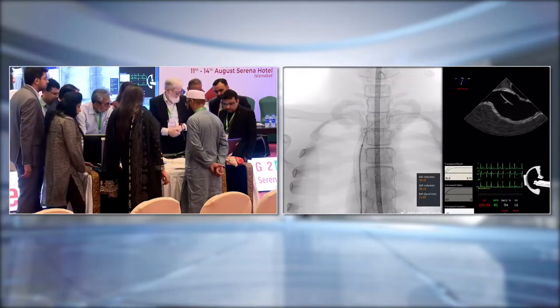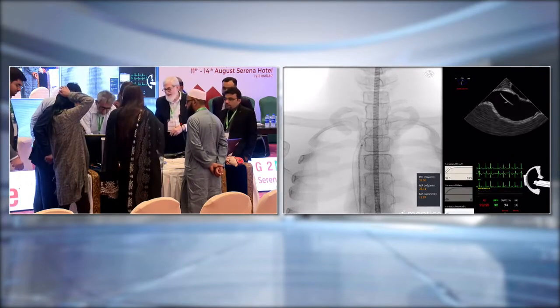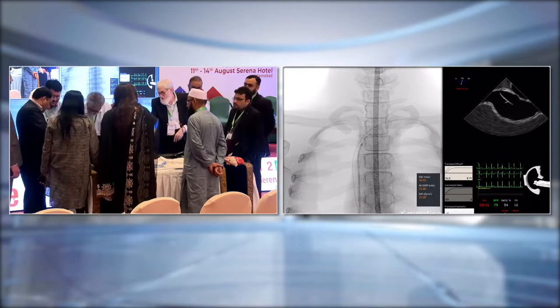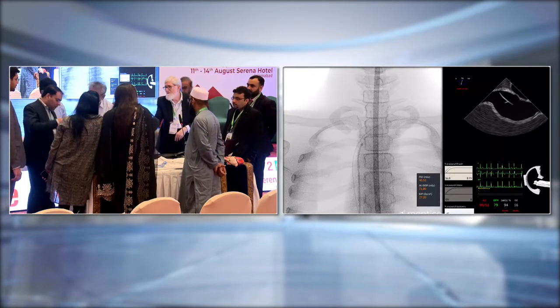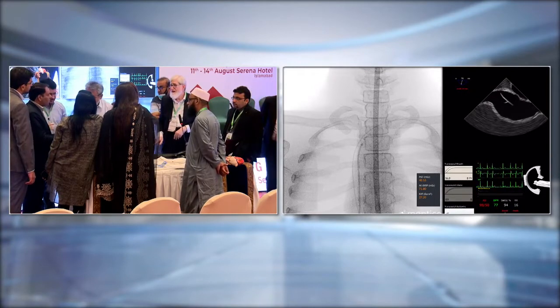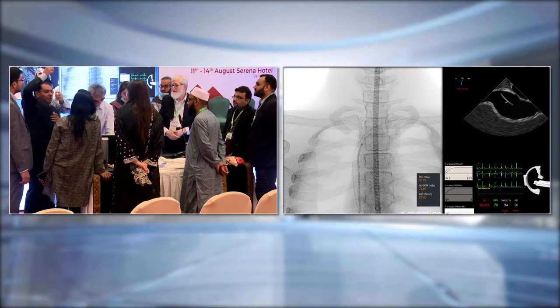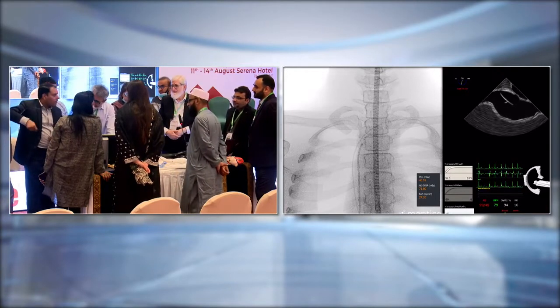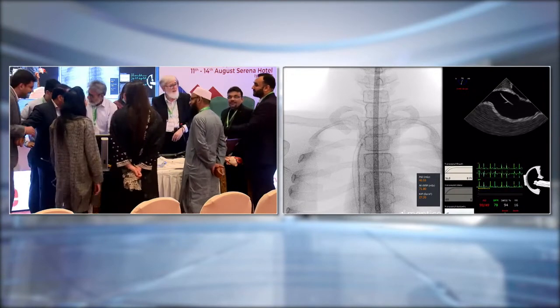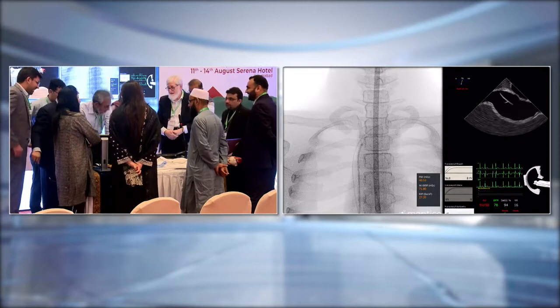हाँ अब वायर निकालनी. सर आप बोलते हैं वायर निकालनी. डायलेटर आपको नहीं डाला है? डायलेटर तो डाला नहीं. इसी वायर के ऊपर ही डायलेटर लगेगा. असल में ये मूलिंग शीट तो रेडी होती है ना, वो यही कह रहे हैं कि डायलेटर हमारे साथ होता है. यहाँ आप सब कुछ खुद ही करें. नहीं यार, ये चॉकलेट दिखा के कहते दवाई है, दवाई को दिखा के चॉकलेट है. अब यहाँ से सिलेक्ट करना होगा ना, डायलेटर को सिलेक्ट करेंगे. डायलेटर ओके. मैंने अरशद साहब को बड़ा कंफ्यूज करा. तो चलो रेडिएशन हो गया?